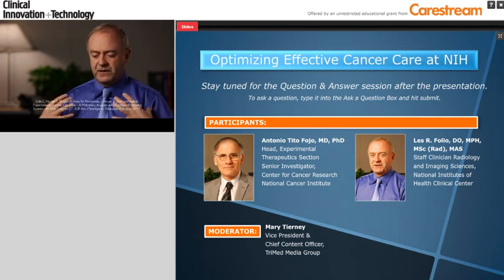I retired from the Air Force in 2009, and research I was doing at that time, because I had experience in Iraq in a combat hospital, we were applying a localization capability within the CT imaging and the PACS to be able to localize blast fragments and ballistic fragments. So one study that we had published in the Radiology Journal several years ago was taking what we called Cartesian positioning system that we identified in another study, where we could take XYZ points anywhere within the body. A person was shot, for example, and take these 2 points, extrapolate them to the location of a shooter. And Carestream has mastered the ability to register over time. So similar to what we were doing with Cartesian positioning system for ballistic fragment identification, we're using in cancer.